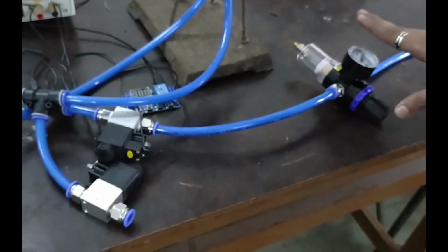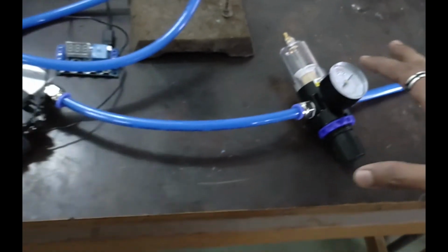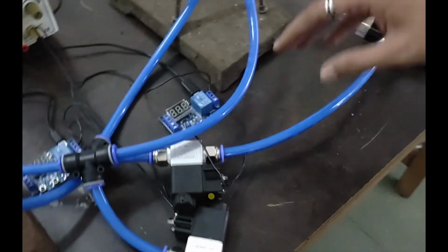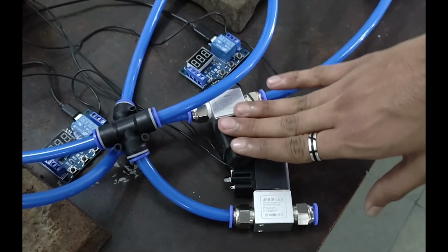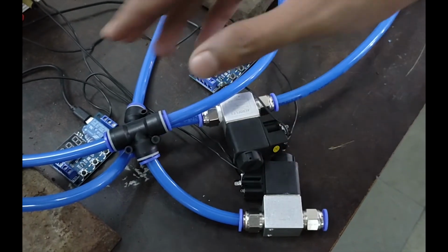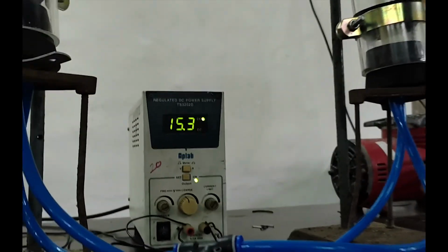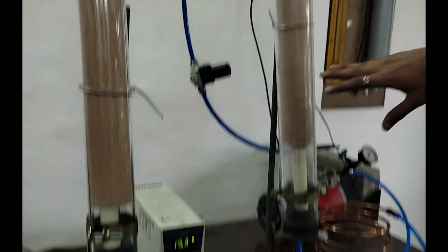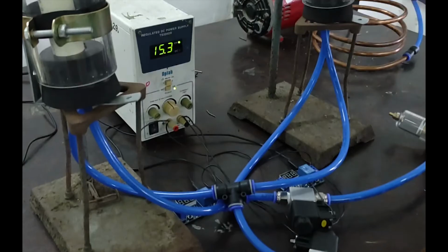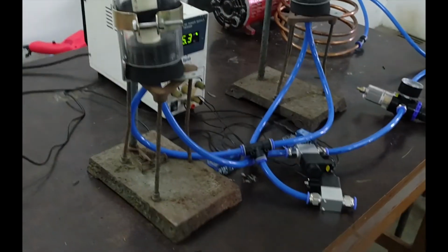and after that the pressure regulator as well as the moisture trap is present over here, and through that moisture trap the air is supplied to the solenoid valve, and the solenoid valve then splits the air into these two columns. These two columns are filled with the zeolite material, which is of 13X size, and we have mounted them on the tripod as well as the stand.